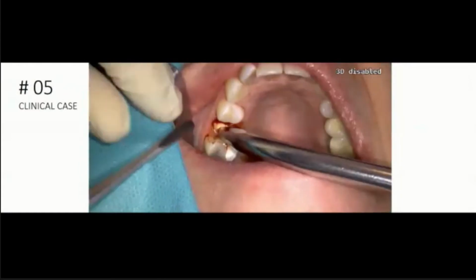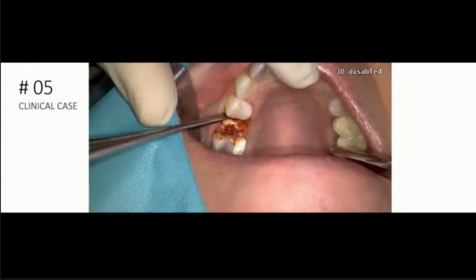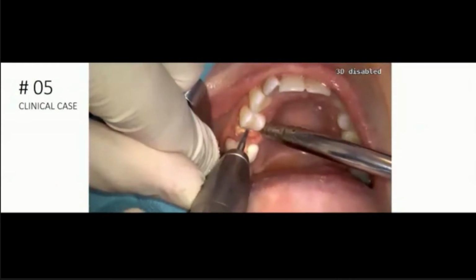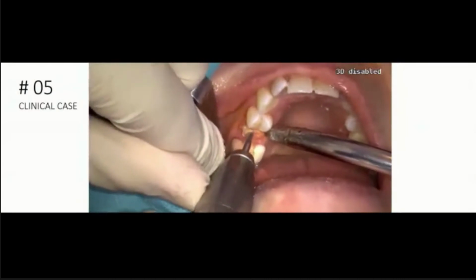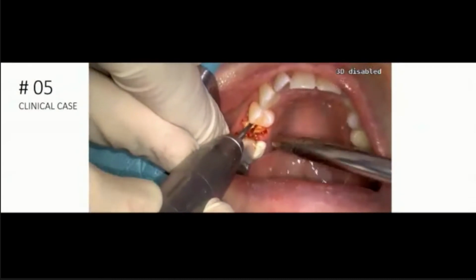This video runs a little bit faster because of the time. There you can see that the crown fractured. And sometimes we have to do an osteotomy. And this shows us very nice. It is very important to do that everything internally.